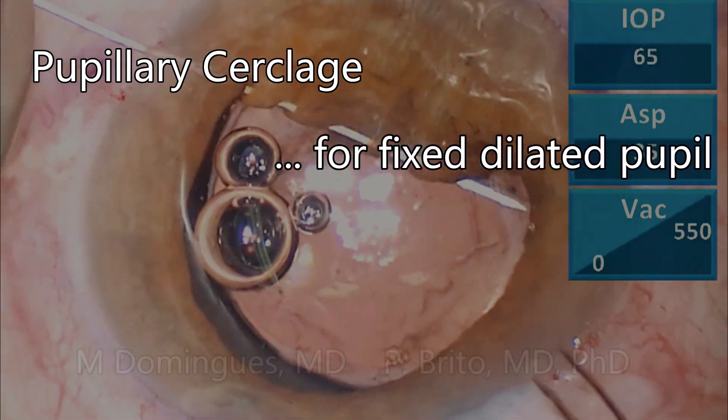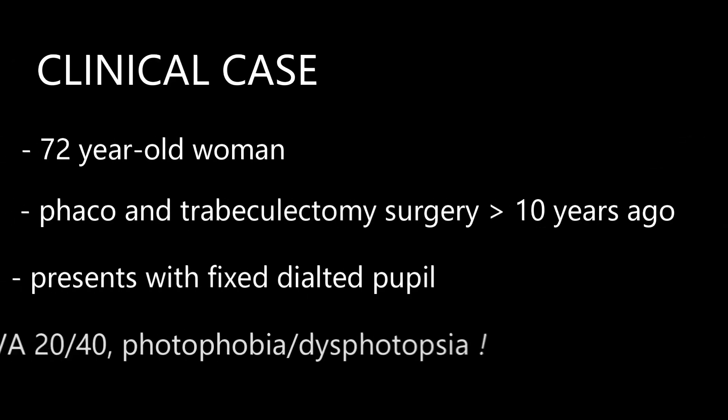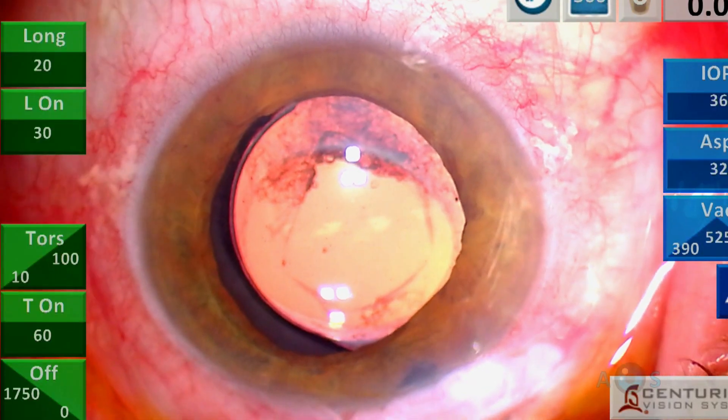This video presents a case of a fixed dilated pupil in a patient who underwent phaco and trabeculectomy a decade ago. This is her best-seeing eye and she is suffering with low vision and photophobia due to the fixed mydriasis.